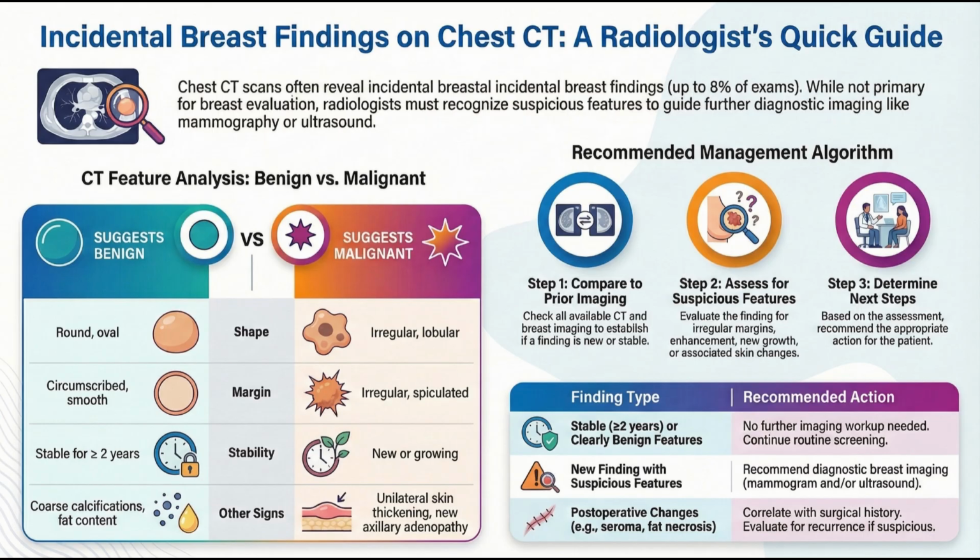So fluid right after surgery is normal? A seroma, a hematoma, sure. But a new fluid collection 2 years later, even if it doesn't look particularly nasty, that is a major red flag for lymphoma and needs investigation. It really shows the power of CT for long-term surveillance.